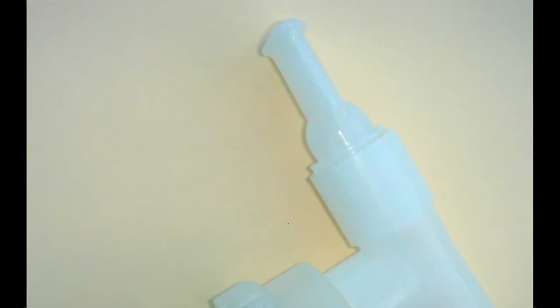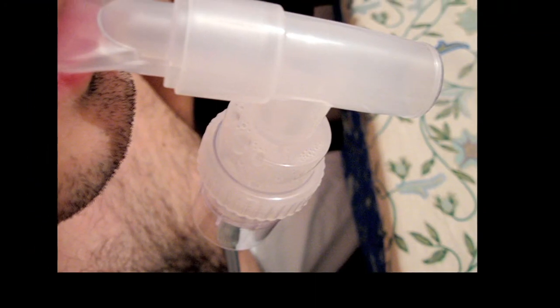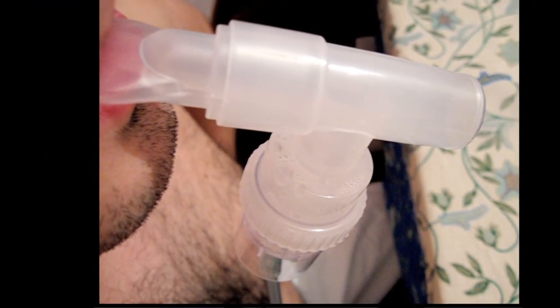So, you have a couple of ways to get these medicines into the child. Number one is a nebulizer machine. This is a machine that makes a fine mist out of liquid medication. The best way to do this is to have a face mask directly over the child's face while you're giving it. Now, some of these come with little pipes that sort of let the mist out. You can try holding it close to the face, but we know that those pipes don't get as much medicine in the child's lung as the face mask.